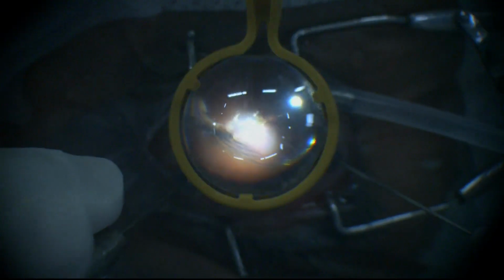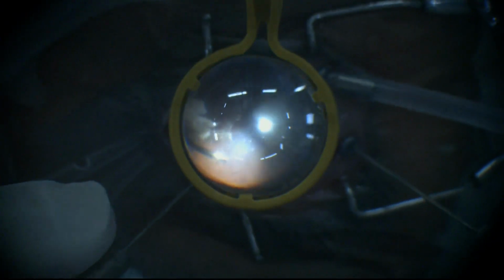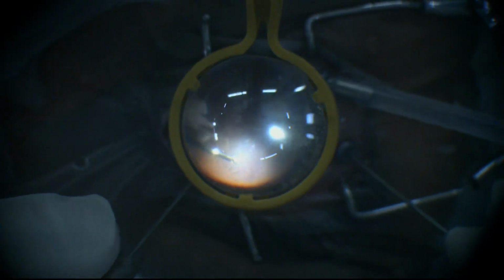आज ही मैं वापस आने वाले को बोल रहा था, your machine doesn't have that feature of automatically switching on the infusion when one goes for vitrectomy, foot switch position 1. And this is what has happened. I didn't switch on the infusion, so the eye became hypotonic. Although it didn't make a difference because before the globe could collapse, I could switch it on.